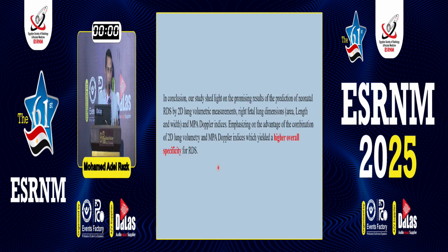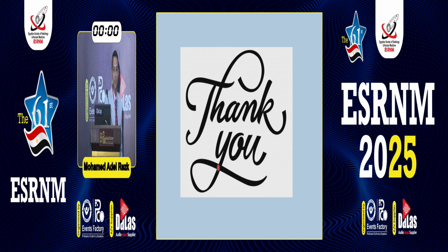So the conclusion: we found that by the combination of the fetal 2D lung volume measurements and the main pulmonary artery Doppler indices, there would be an overall higher specificity for the detection of fetal respiratory distress. This is all, and I'd like to thank you very much.